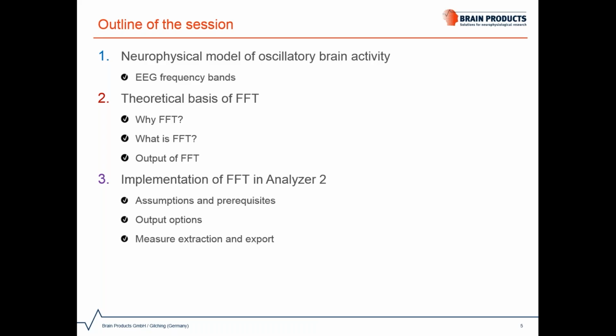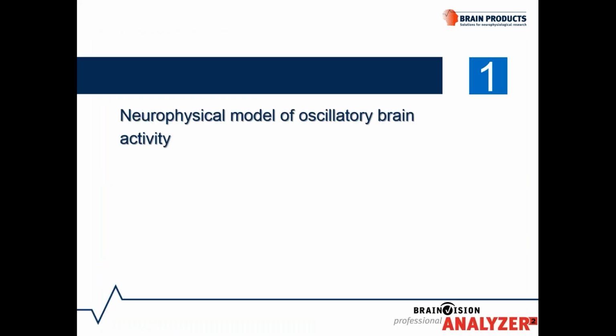In this section, we will also open up Analyzer and demonstrate how to use FFT using experimental data. Then we will have time for open questions. Please feel free to send your questions at any time to the moderation team. Finally, we will close the webinar by providing you the main take-home messages as well as some recommendations for further reading. Okay, so let's go step by step and start with some theoretical background.